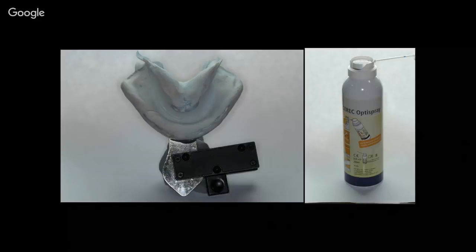Okay, there's another question: is there issues with teeth popping out when you're using the bonding agent for setting the teeth? Yeah. So here again, this is a little bit the Wild West right now, and these are some of the questions we've got to figure out. Historically, based on some other digital denture systems, I've heard that there can be issues of teeth popping out because you've got this printed material, which is more akin to a bisacryl or almost like a flowable resin, and then you've got these PMMA denture teeth. And how good is the bond between these?